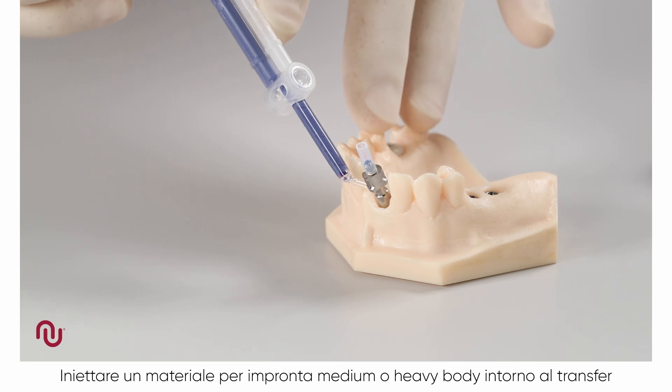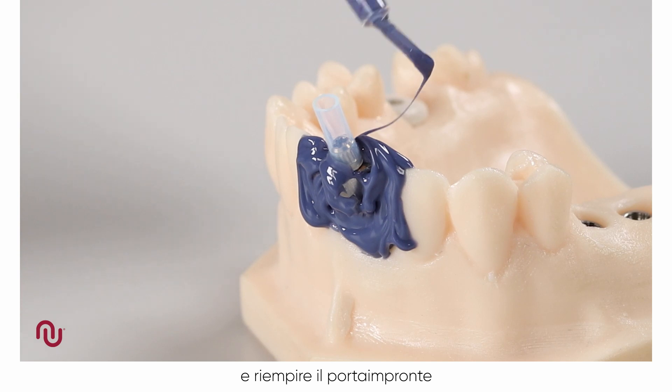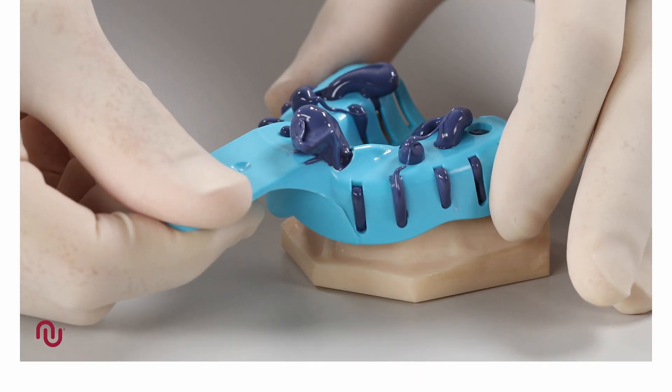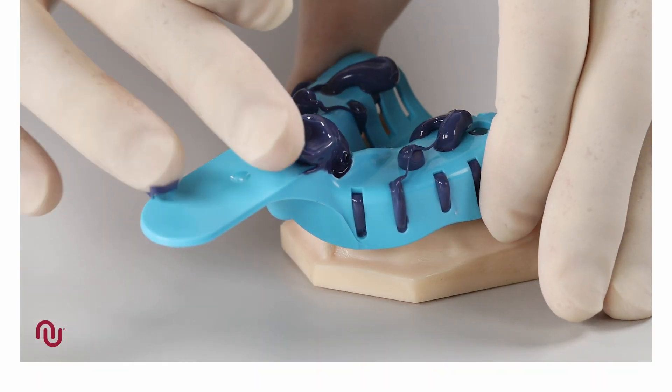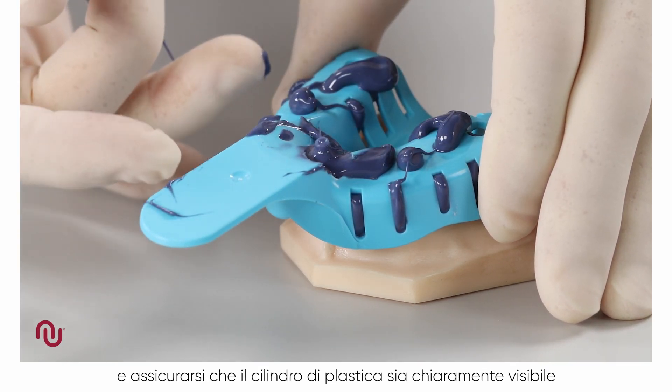Using a medium to heavy body impression material, inject around the impression coping and fill the impression tray. Seat the impression tray into the patient and ensure the plastic tube is clearly visible.